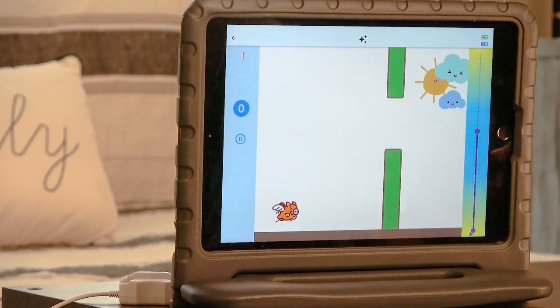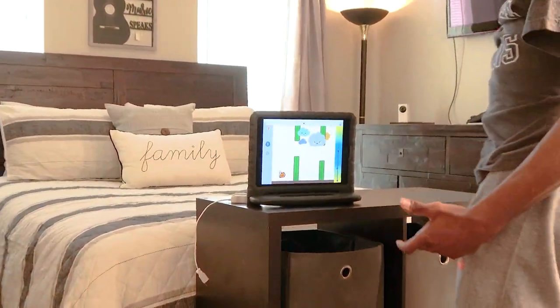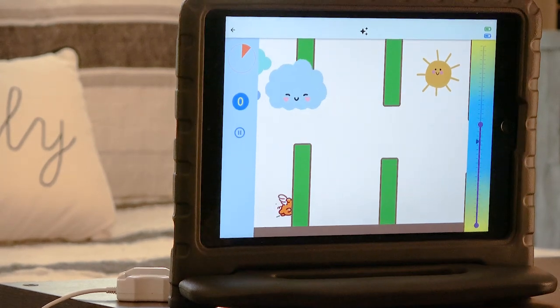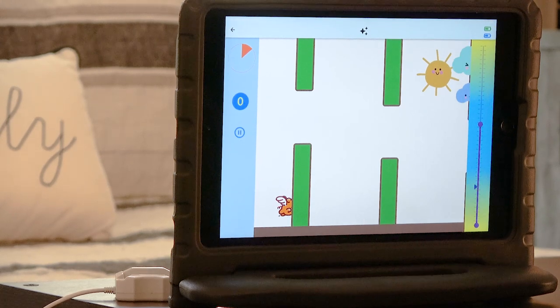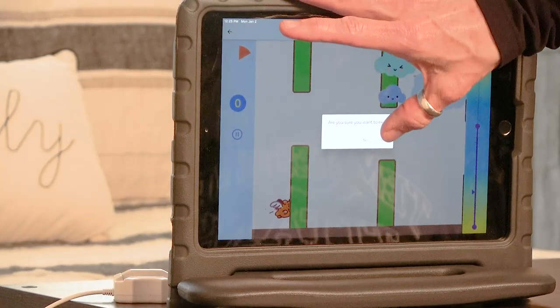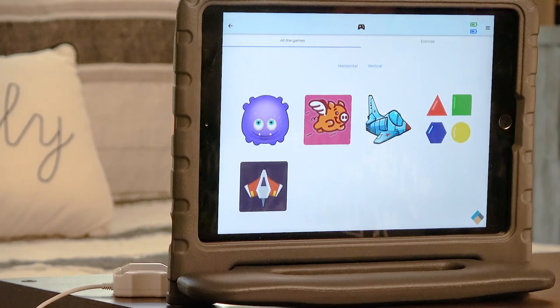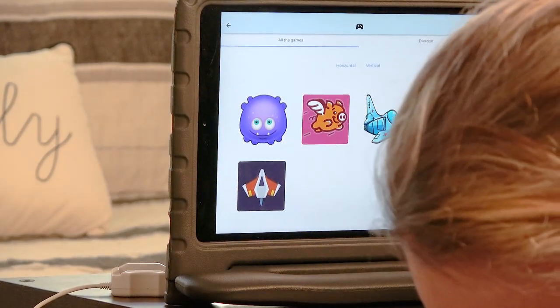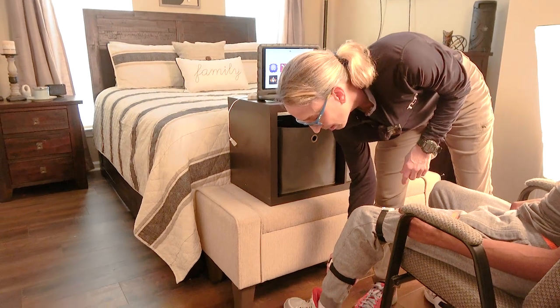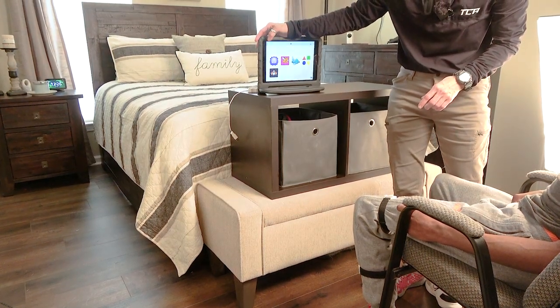You're going down, so you're going to need to stand up to make that pig go up. We're not able to get to the range that we need to get to, so let's go back and try again. I'm wondering if he started with his knees not bent well — his legs were fairly straight. If he started from that screen with his knees that straight, then it may have messed up our movement. So let's try it again.